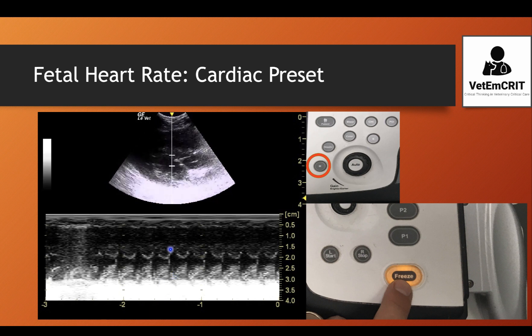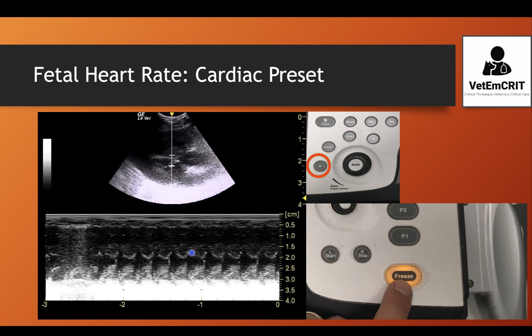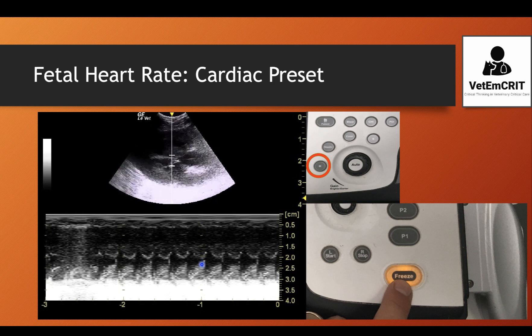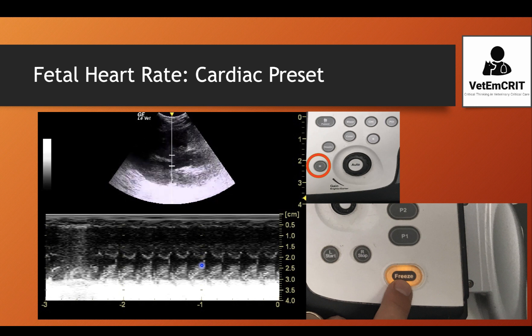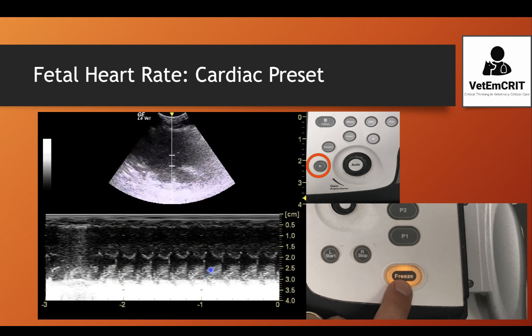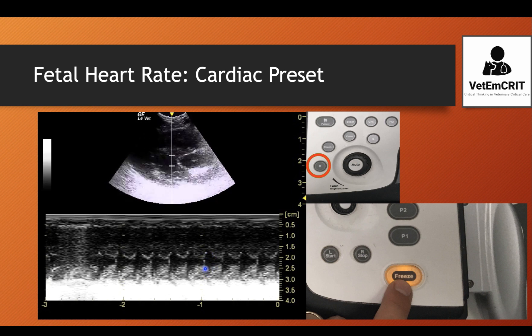By looking at the still image in M-mode, you should be able to differentiate between systole and diastole. During systole, the left ventricle of the fetus will contract and the lumen between the two walls of the left ventricle will be diminished, as opposed to diastole when the left ventricle is relaxed and the lumen will be enlarged in its diameter.